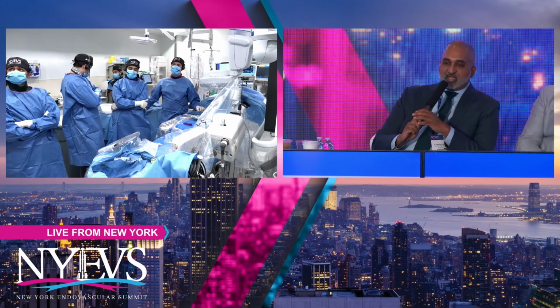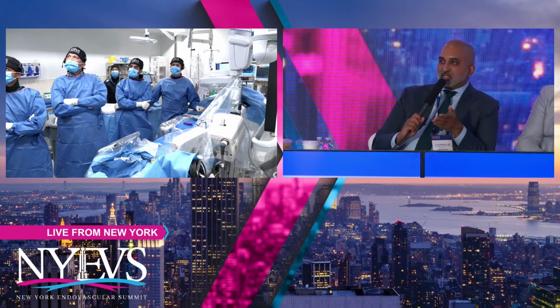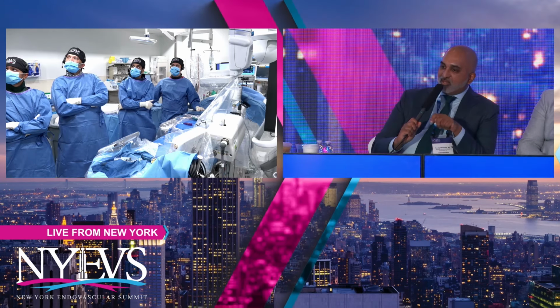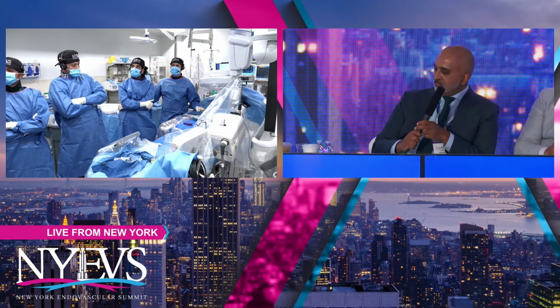I see you put the filter down, so I think that's a great plan. But one option, like I said, is instead of having to do that up front, you can just treat the stent, and then once you're ready to cross at the very end, you pop through after you've treated the proximal.